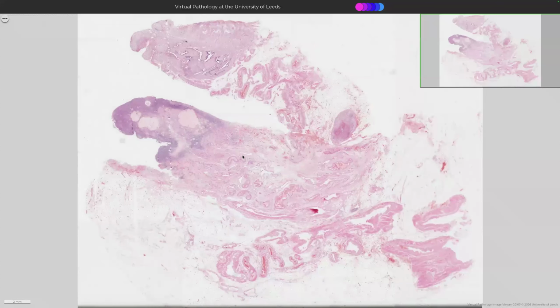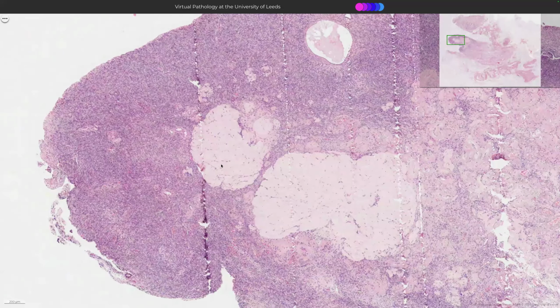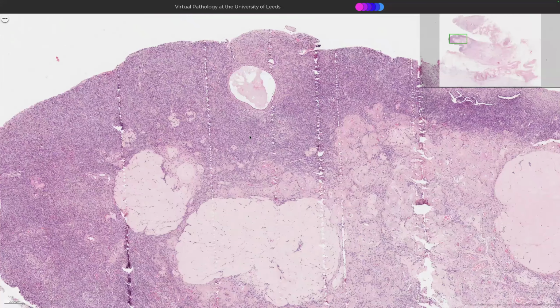This is another cute thing. So I quite like teaching you guys cute things that you will encounter but not necessarily know what they are. So we've got fat, we've got ovary here, right? Do you think this ovary is premenopausal or postmenopausal? Yeah, that's right. It's postmenopausal because we can't see any of the little ova. And really, we don't have any active follicles. We've got lots of these corpora albicantes. And what's this here?